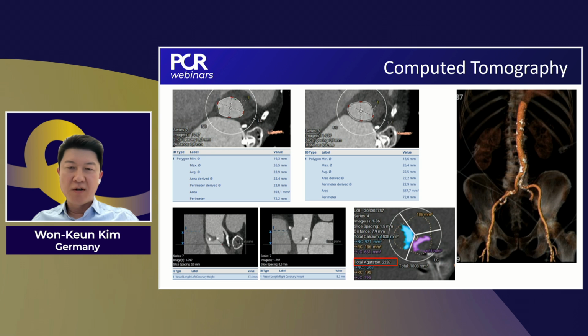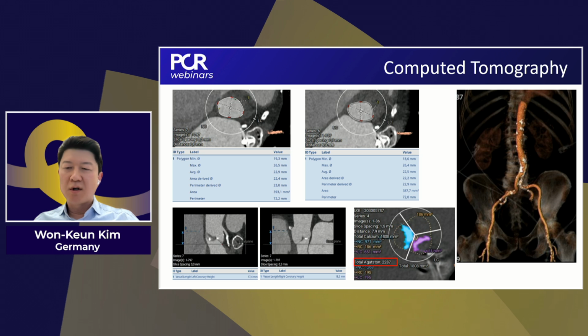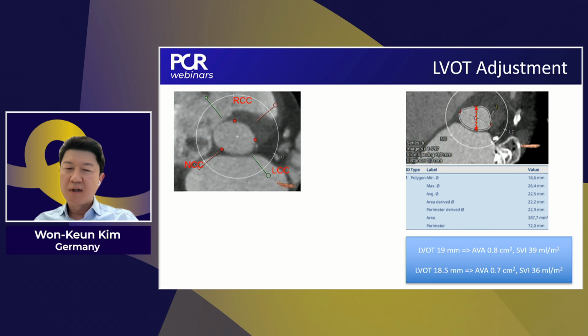and you can also see what it looks like on 4D. So of course we did a computed tomography to measure the annulus and the LVOT diameter. You can see the coronary distance, and most importantly, we looked at the Agatston score, which was higher than 2,000 Agatston units. And this would classify the patient, or at least indicate, that the aortic stenosis most likely is severe.